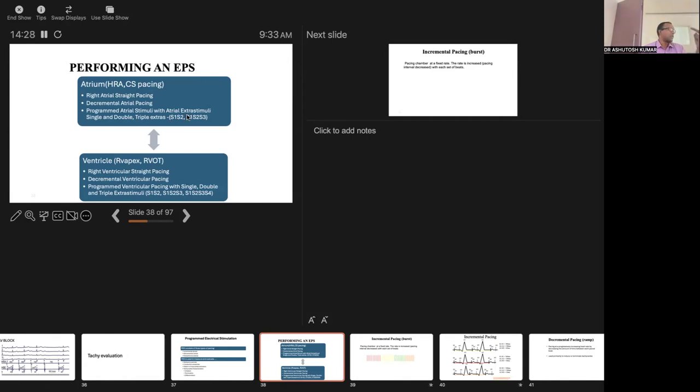Means we are giving one cycle length, and why are we giving one cycle length and then giving extra? We are giving 8 beats followed by one extra beat. Is it there or not? What we use extra for. Why do we want to give 8 or 7 or 6, whatever the initial beats, and how do we identify how many we have to give? These two questions.